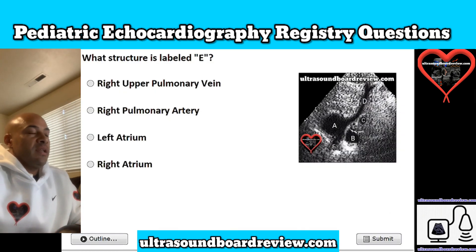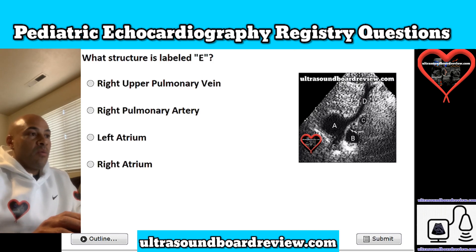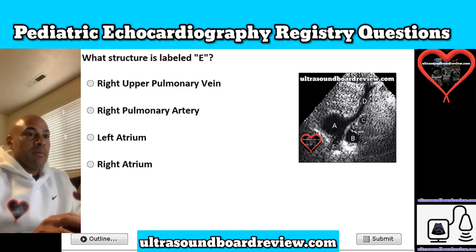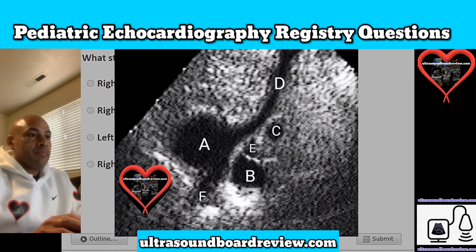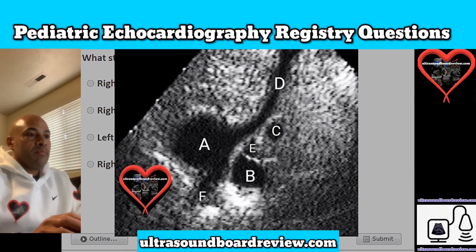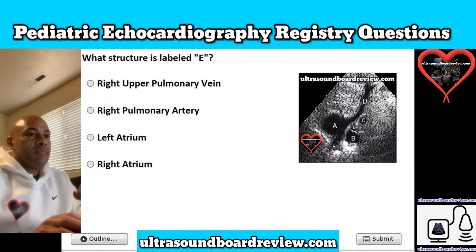Question 14. What structure is labeled E? Is it A, right upper pulmonary vein; B, right pulmonary artery; C, left atrium; or D, right atrium? The answer is right upper pulmonary vein.